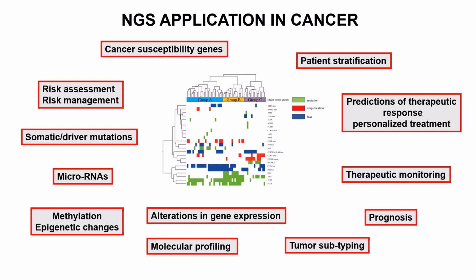Some key applications are genomic profiling. In fact, it allows a comprehensive analysis of cancer genomes, identifying mutations, copy number alterations, structural variants, and other genetic changes. Then we can also do mutation detection. So, for example, single nucleotide variants, insertions and deletions, gene fusions.